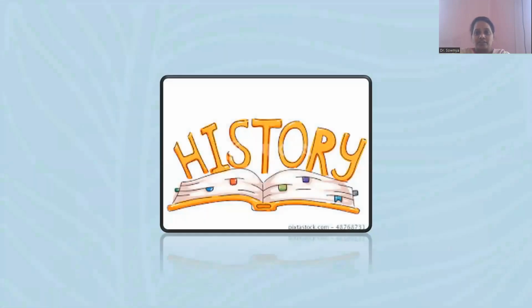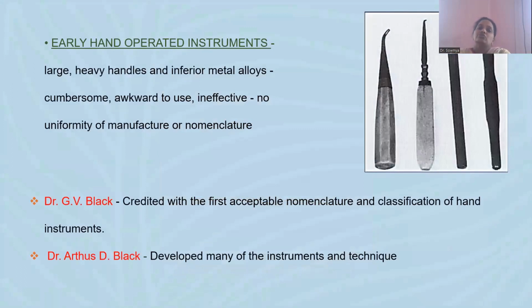Now, first coming to the history. Early hand-operated instruments were almost of this shape. They used to be large, with heavy handles and inferior metal alloys. Cumbersome, awkward to use, ineffective, with no uniformity in manufacture or nomenclature. Usually, they didn't have any specified features for their manufacturing.